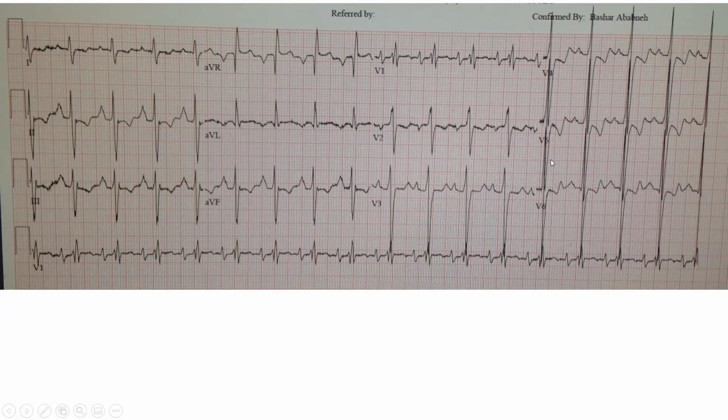Normally, when you have hypertrophy of one ventricle, it's one of them that is high, not both. Here you have hypertrophy of both ventricles, so you have a huge R and a huge S. You have other criteria for biventricular hypertrophy. He fulfills the voltage criteria for LVH in many ways. He also fulfills voltage criteria for RVH by the S being smaller than R in V1. But the Katz-Wachtel, very big R and big S, more than 4 or 5 squares in V4, V5, is a sign of biventricular hypertrophy, especially Eisenmenger, well described with VSD with Eisenmenger.